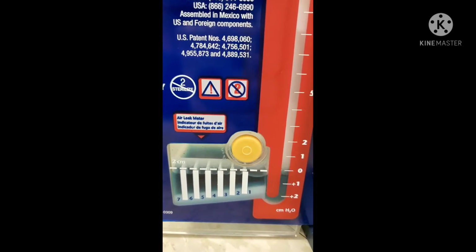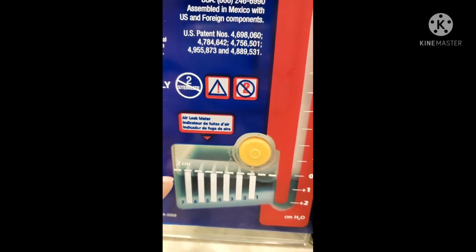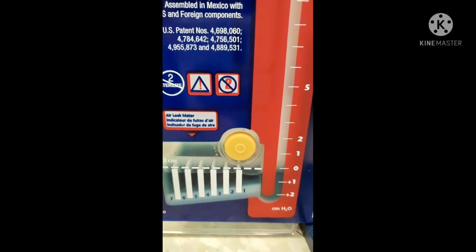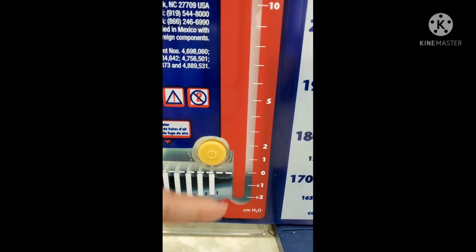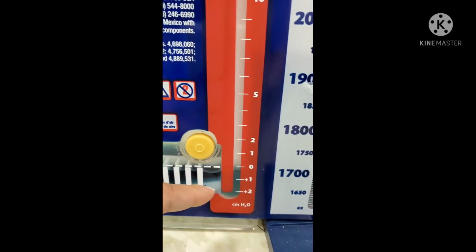Here I have no bubbling and my water line is at the 2 centimeter mark where I want it to be, so that's good. Now, if my patient had a pneumothorax, there may be an occasional bubble right here, and that's normal considering that there's air escaping from the pleural space. It might come into the chest tube, and that's okay.